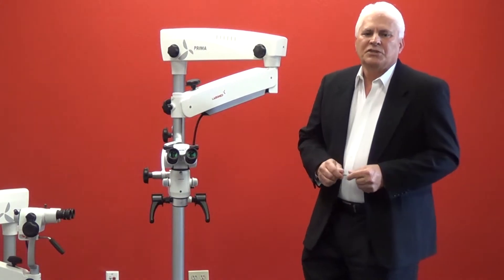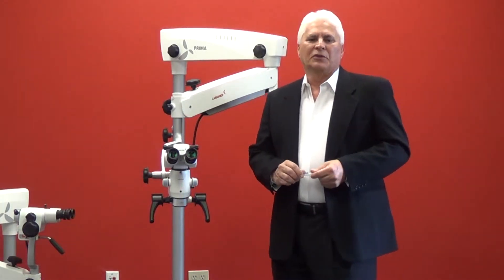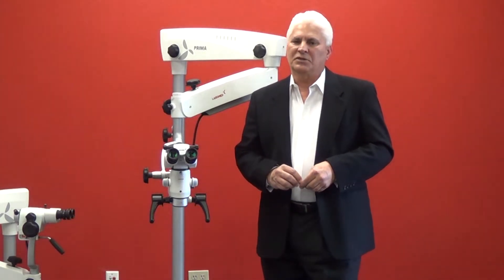What we need to educate doctors about is what sets the various brands of microscopes apart today. These are broken down to three critical differentiators: optics, mechanics, and illumination.